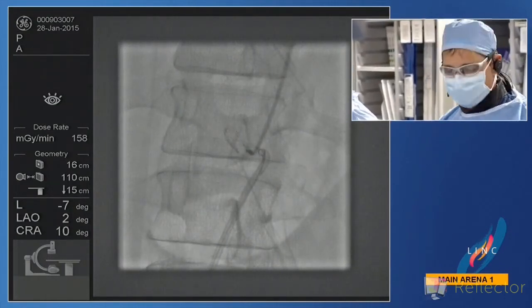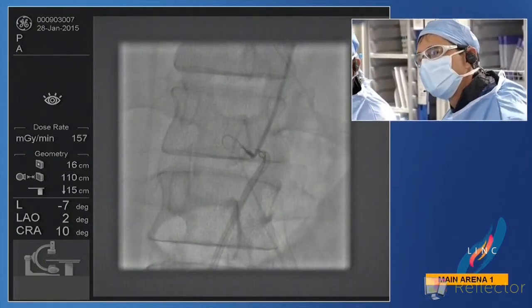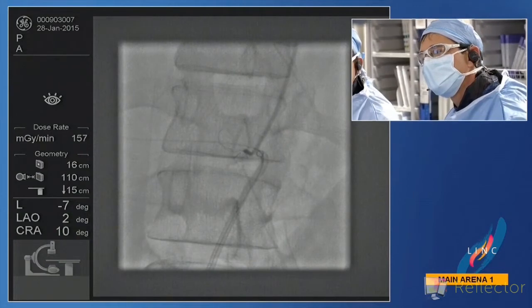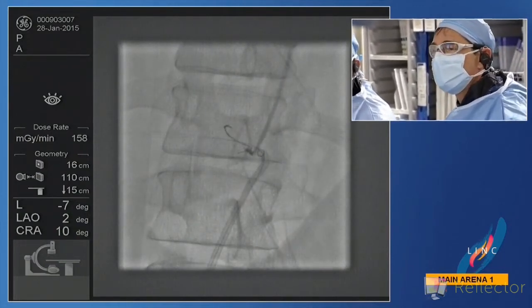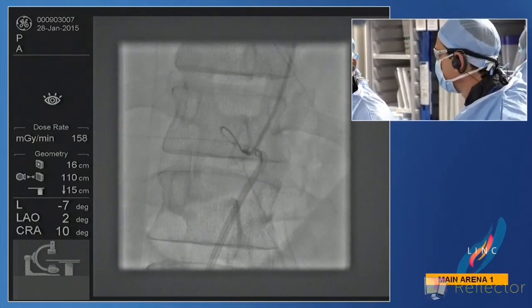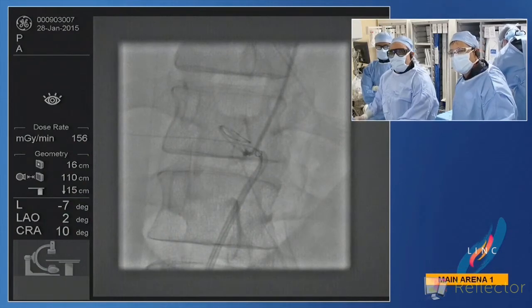Obviously, the plan sounds great on PowerPoint, and then implementing this component of it can be a little challenging, especially once we have this wire and we've straightened out the communication between the celiac and the hepatic. I think when we started, they had the wire in the splenic, and obviously on camera we're trying to move quickly with both wires.